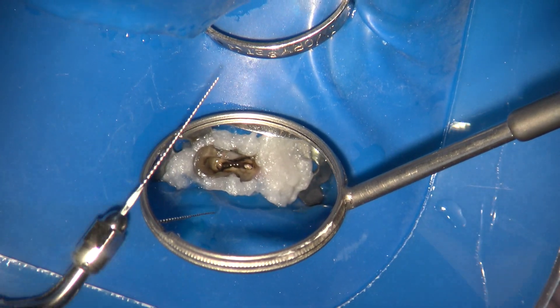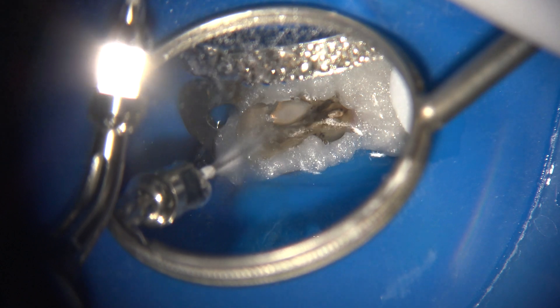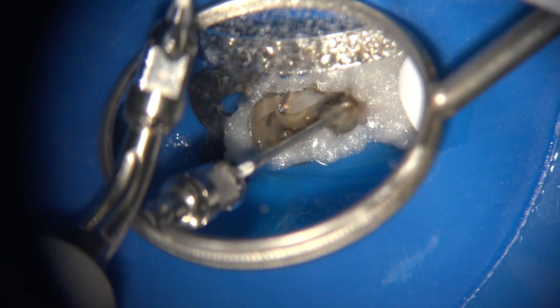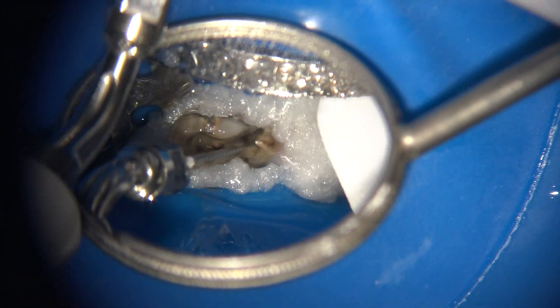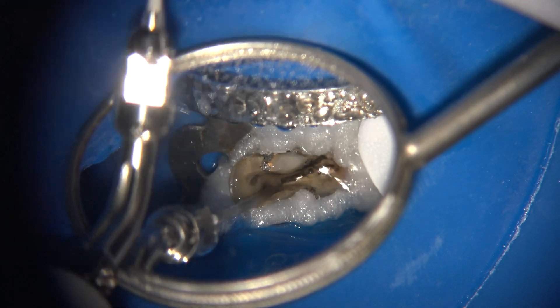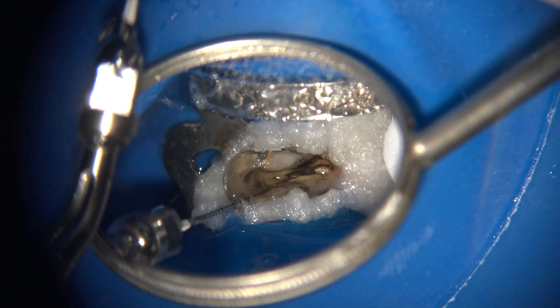Here I make the trough around the silver point using my E14D ultrasonic tip, which has a diamond coating, then proceeded to use the E11 or E12 tip depending on the angle needed. I used the E11 tip with a U-bladed file to get deep in there and trough around the silver point. Under the microscope, I could see there was a complete friction grip between the dentin and the silver point — not enough room to snake in a file. Oftentimes if there's more room, you can snake in a Hedström file to engage the side of the silver point and pull it out.